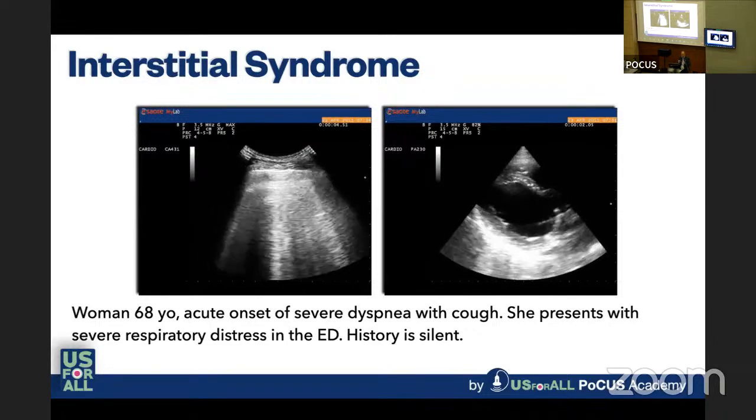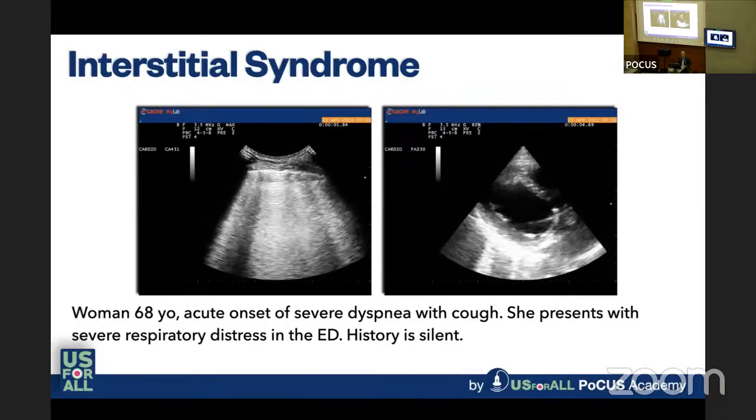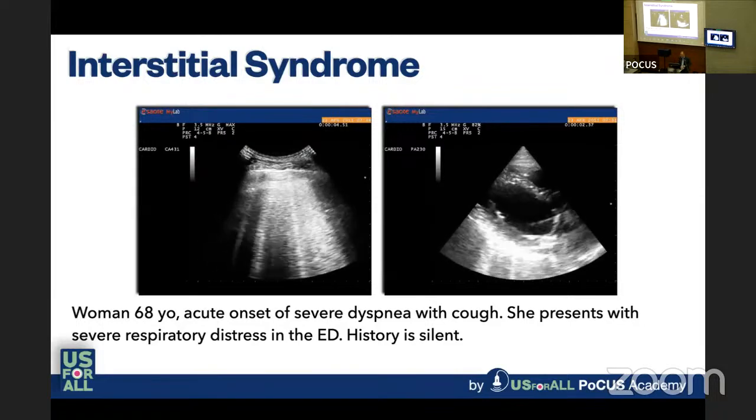That is a very basic eyeball examination of the left ventricle function.